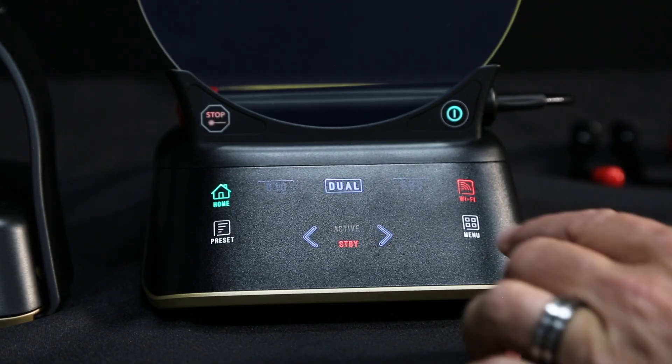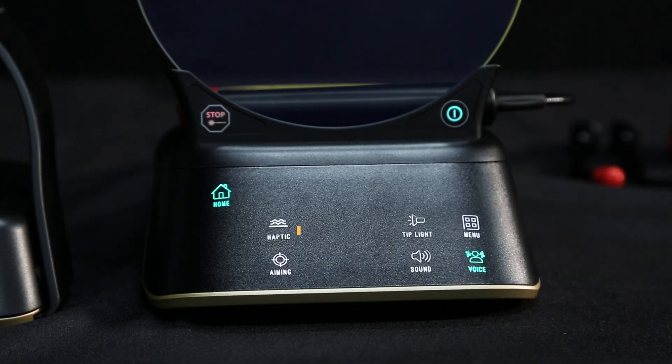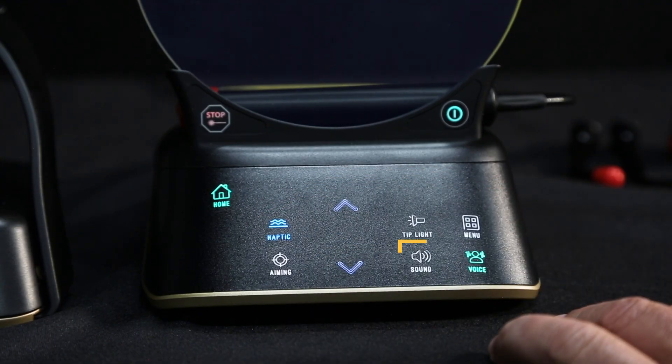Pressing the menu button brings up the options for haptic sense, aiming light, tip illumination, and sound settings.